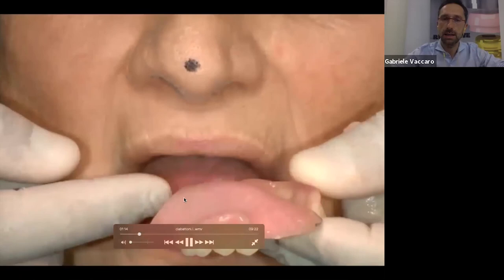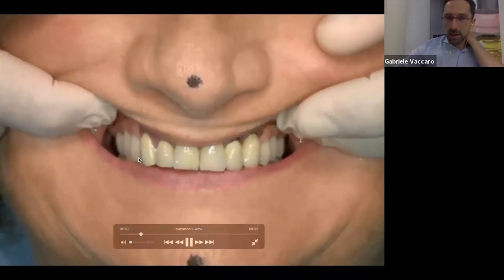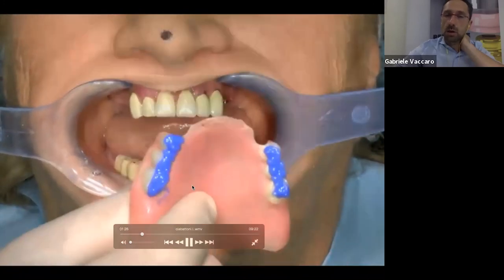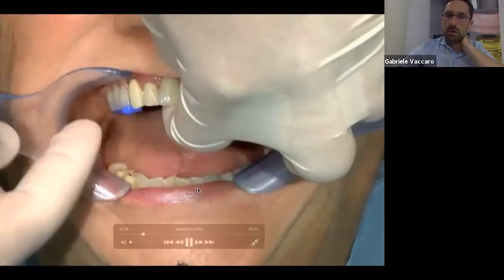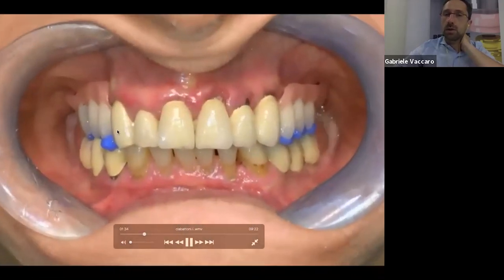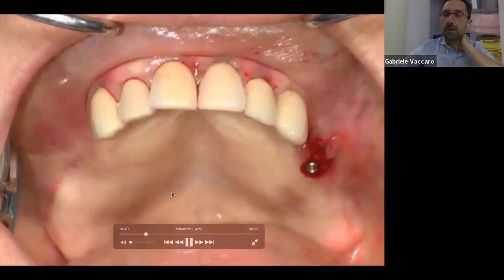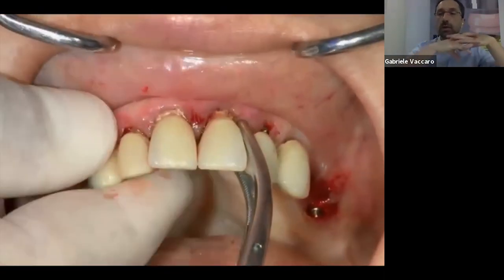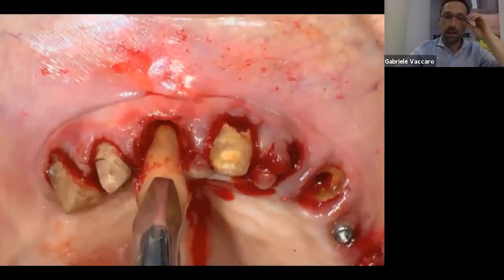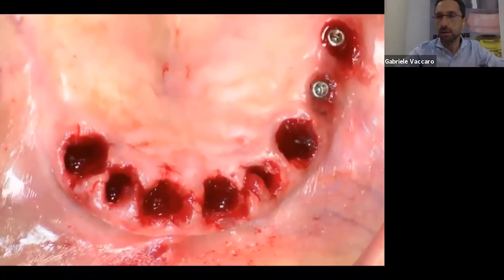Before we start, we check the vertical height with the impression tray that we have already built. Then we lock the bite of the patient, the occlusion of the patient. We lock everything with resin. This is resin, because we are going to take the impression after the surgery exactly with this. And we need a strong guide for the patient to know where to rest her jaw, because after that the patient will be tired with a lot of anesthesia. And to register the vertical height after the surgery is difficult without any guide.